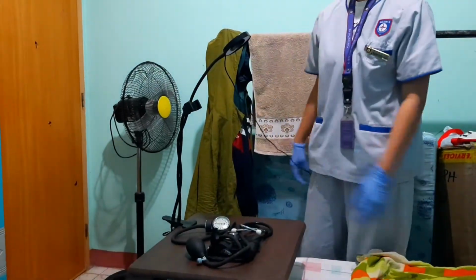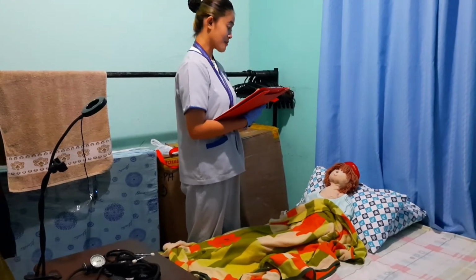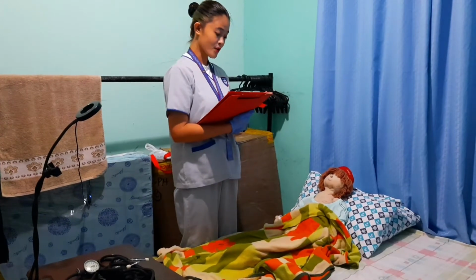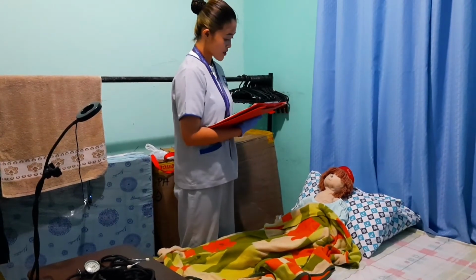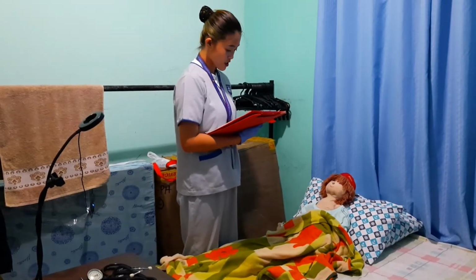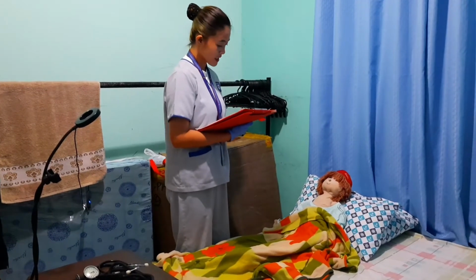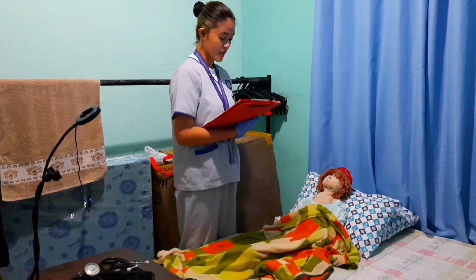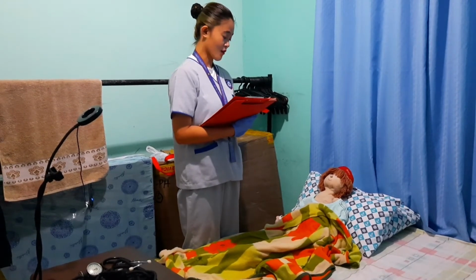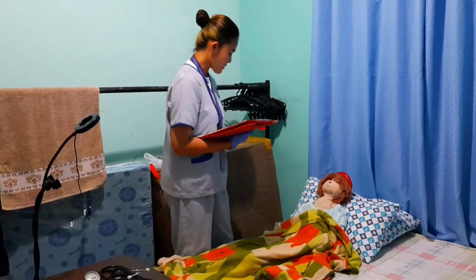Now that we're done, we have to introduce ourselves. I'm your student nurse for today from Medici de Makati College. So I am here to do the Perilight procedure in order for you to reduce the swelling of your wound and to increase the circulation on the episiotomy site. And I would also promote the healing by increasing the oxygenation to your tissues and of course to prevent any cases of infection. So may I just verify your identity, ma'am?